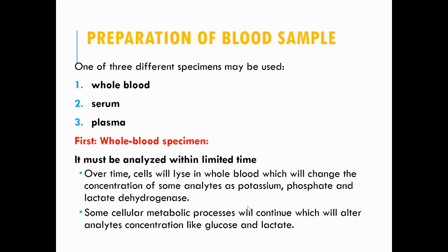Now, preparation of blood sample. One of three different specimens may be used. So it could be whole blood, it could be serum, and it could be plasma. So first, a whole blood specimen.